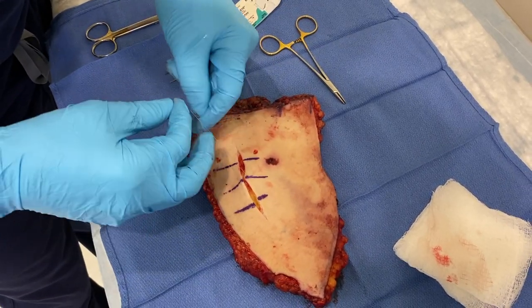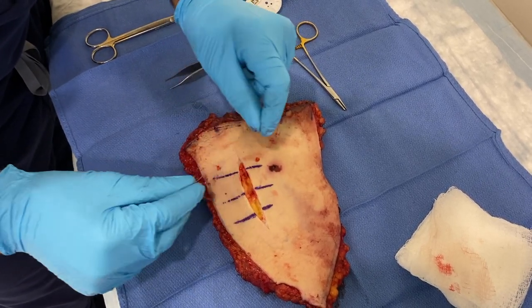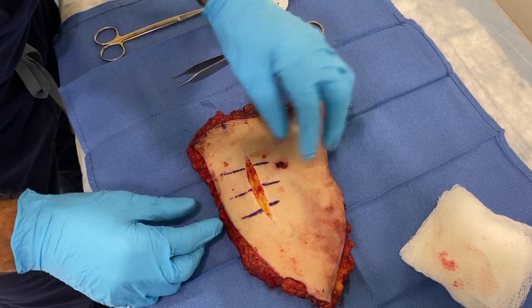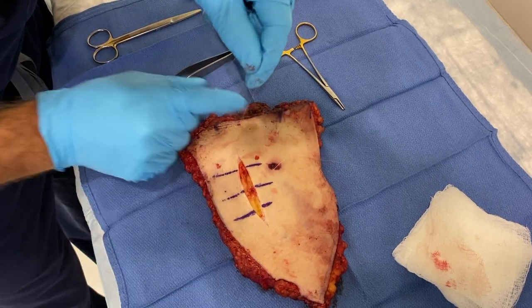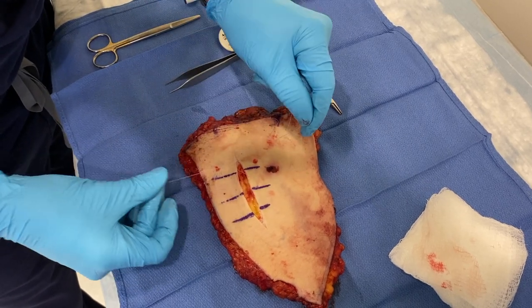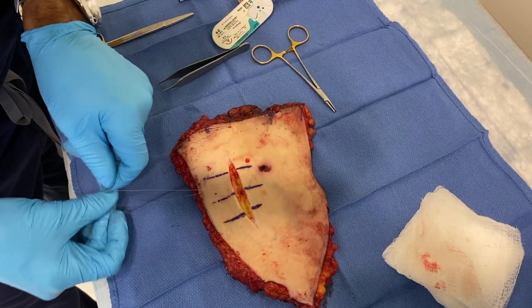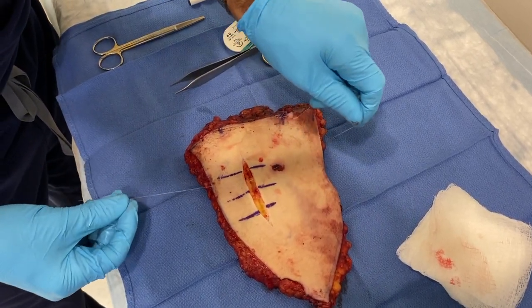I'm going to show you a tie using my hands — a hand tie. It doesn't matter how you create that loop; there are all kinds of fancy ways with your finger, you can watch YouTube on that. But basically, all you're doing is creating two throws and bringing it down square. Square means bringing it down like this as opposed to like that — the untangled look is square.